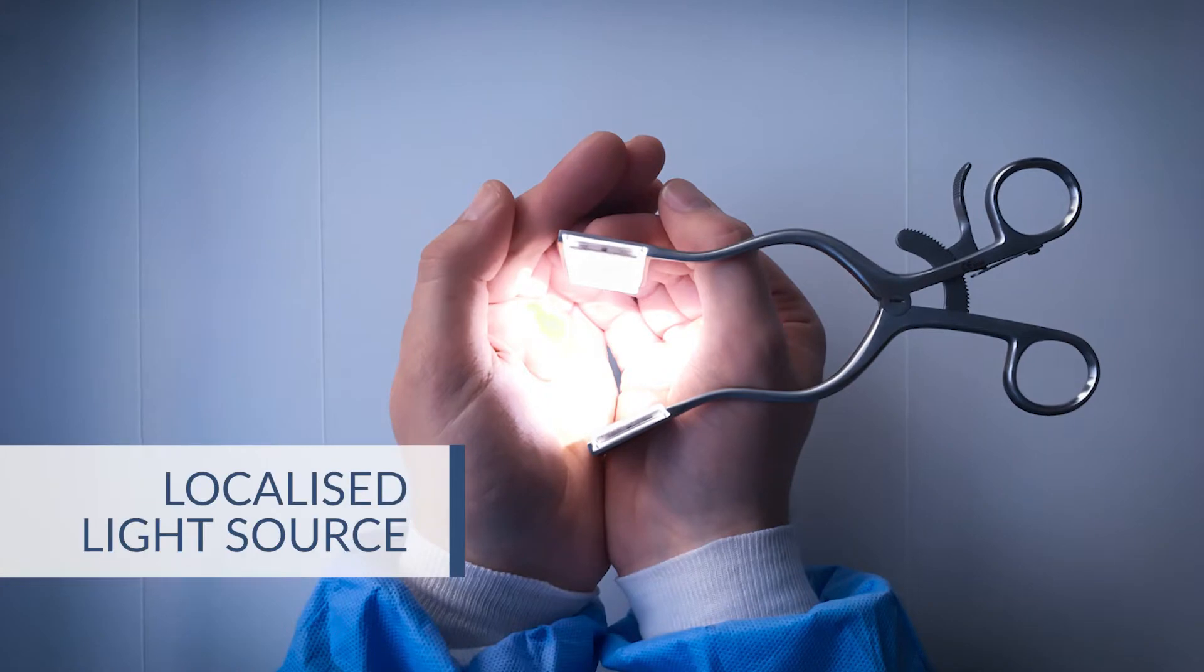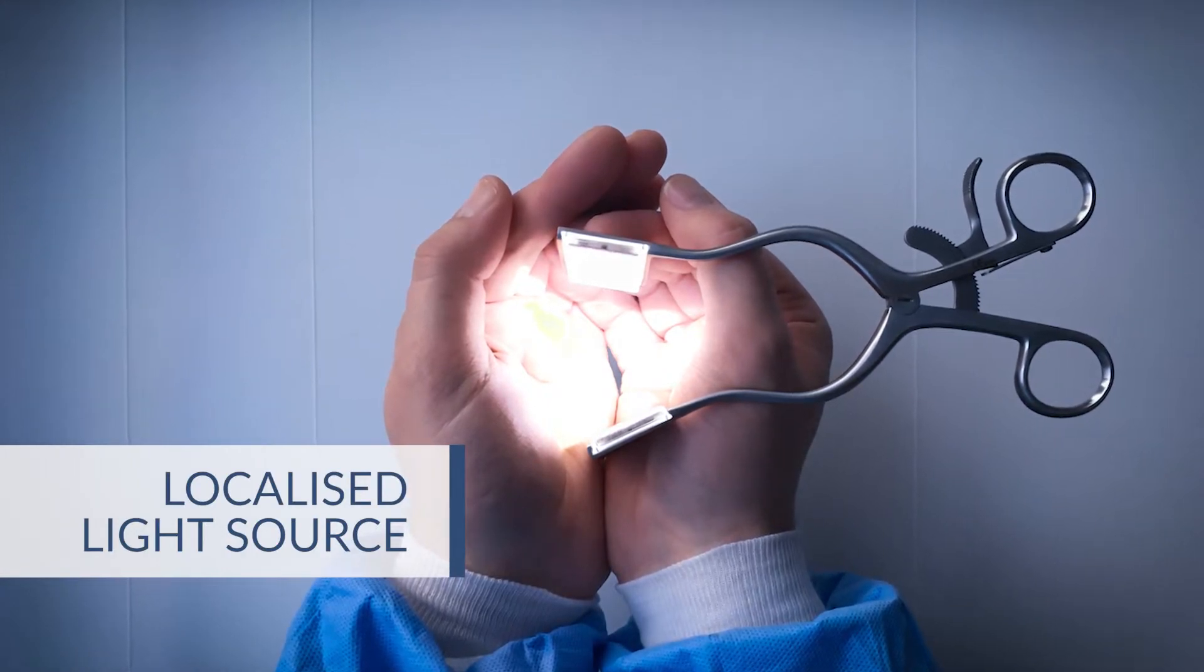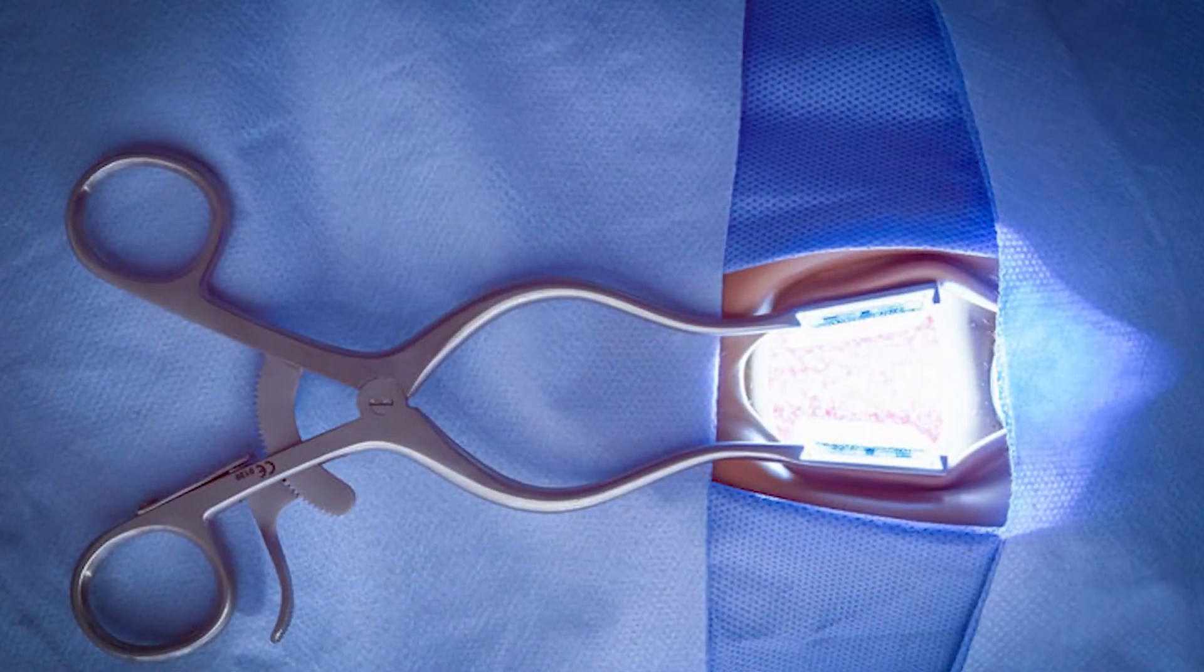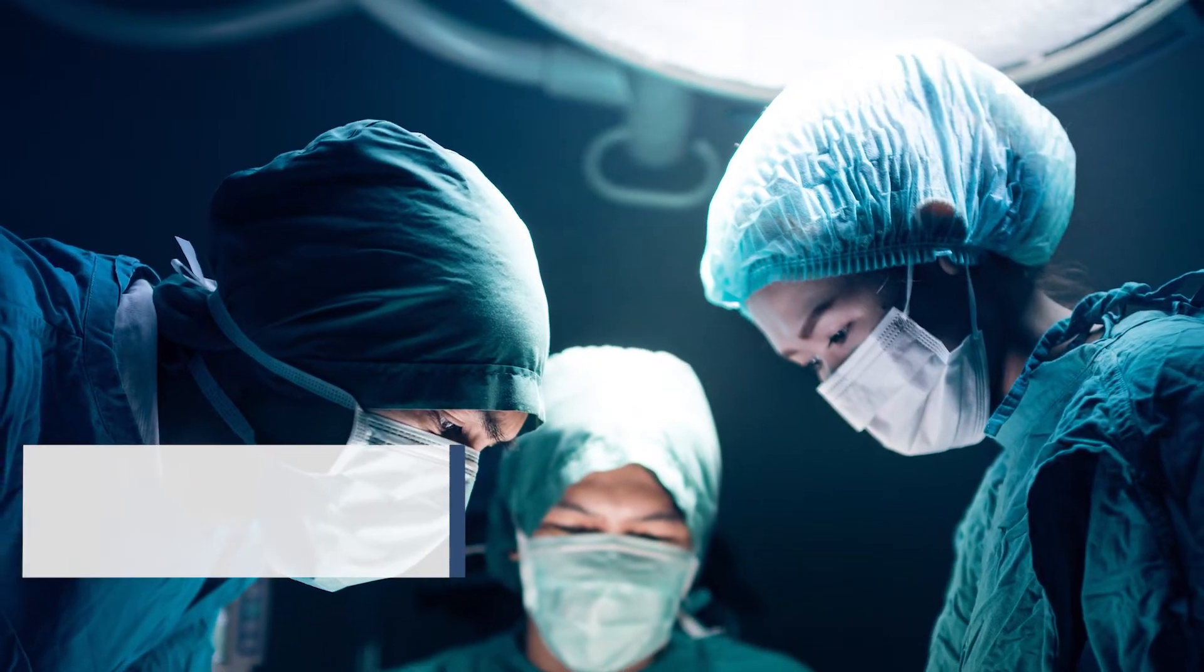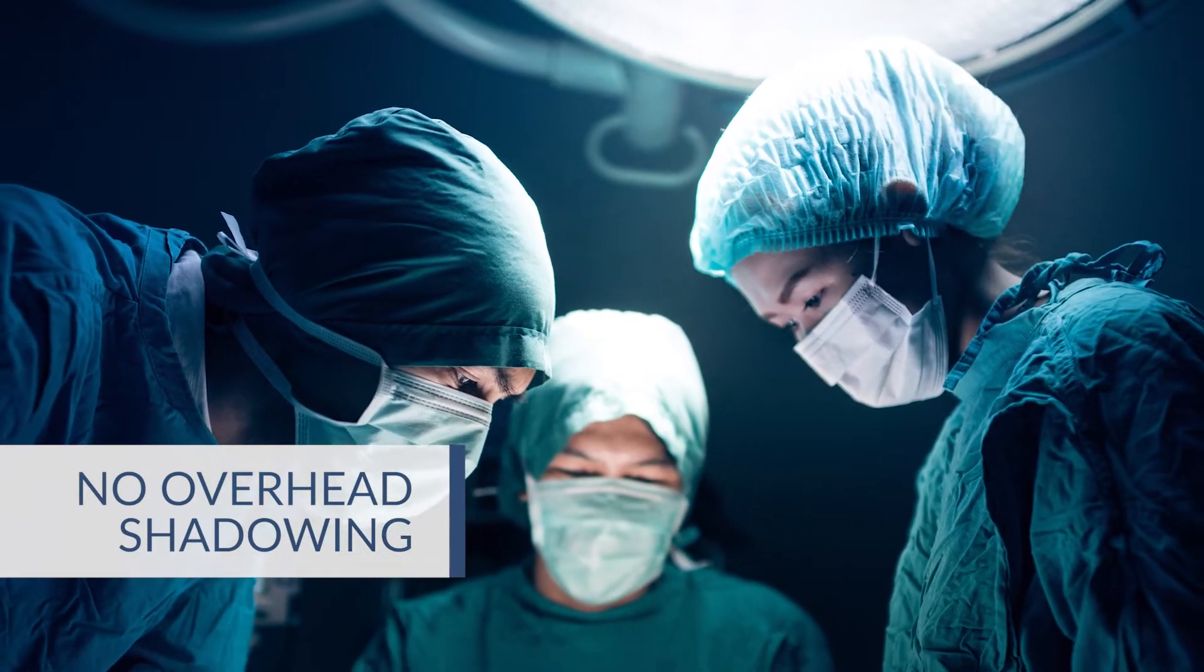The OpLite is a localized light source integrated into the surgeon's retractors. It creates a well-lit surgical zone that is unimpaired by the bodies of the surgical staff. No more overhead shadowing.